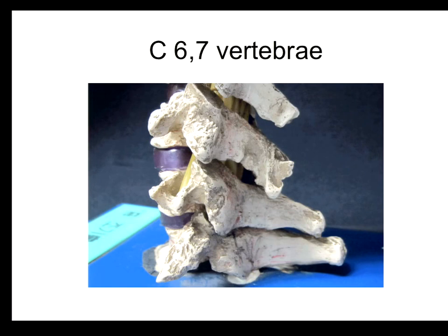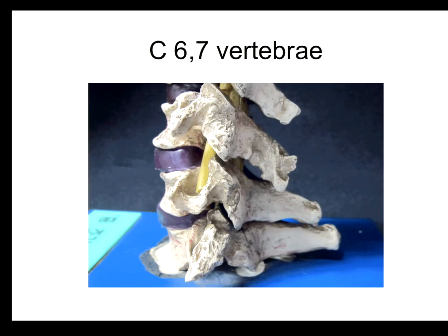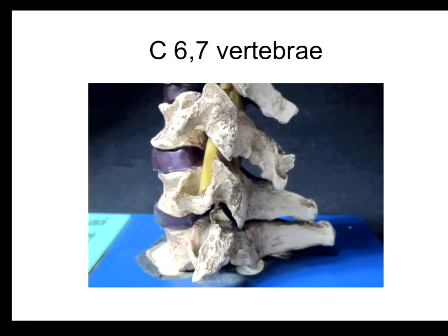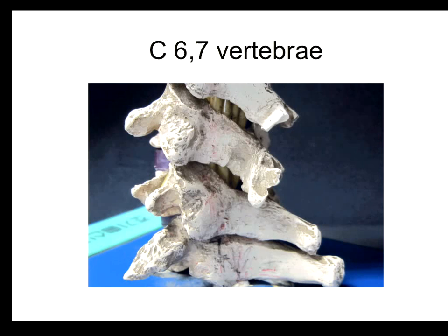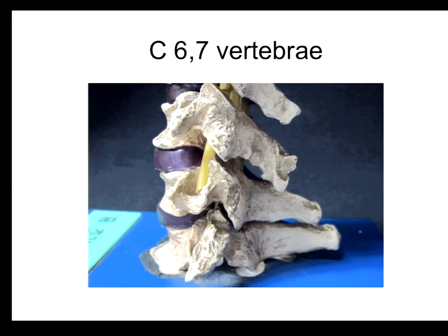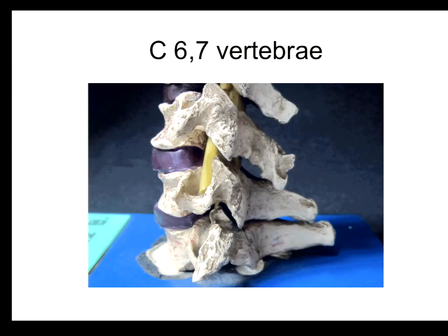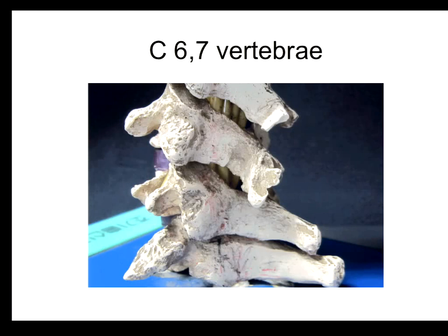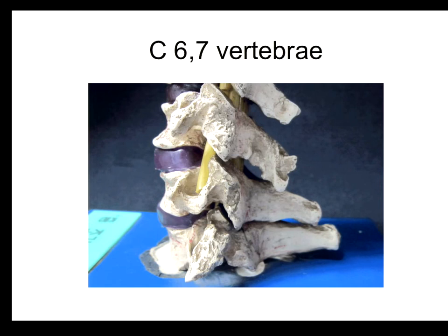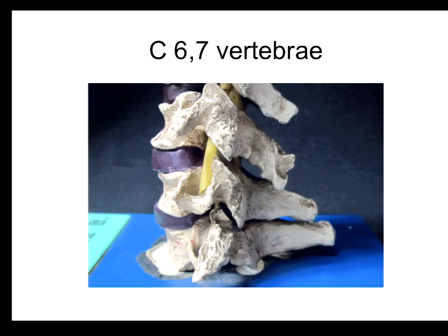At C6, you can see a more prominent posterior tubercle but a smaller and less prominent articular pillar. Another way to differentiate C5 from C6 is the wide gap between posterior tubercle and articular pillar at C6. At C7, you cannot see any division of anterior and posterior tubercle from the transverse process scan. The transverse process is very prominent, and there is no visible articular pillar at C7.